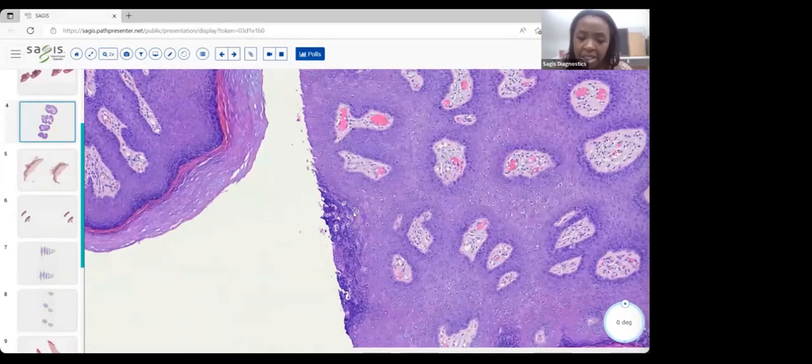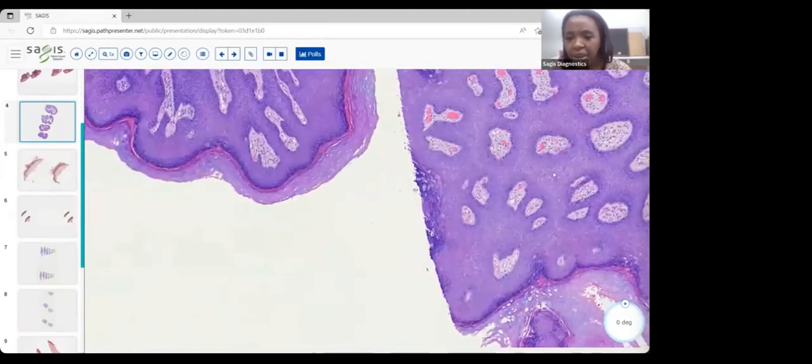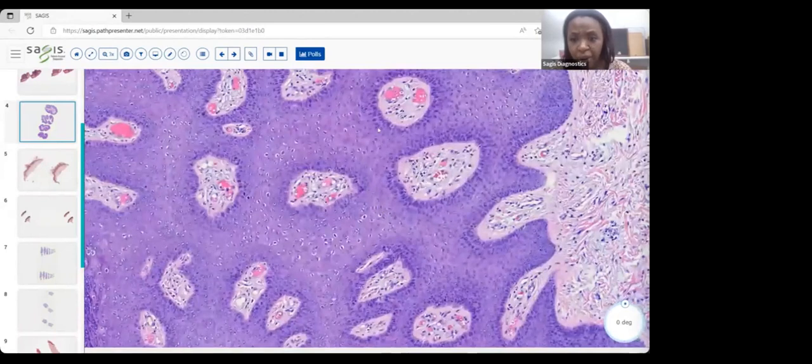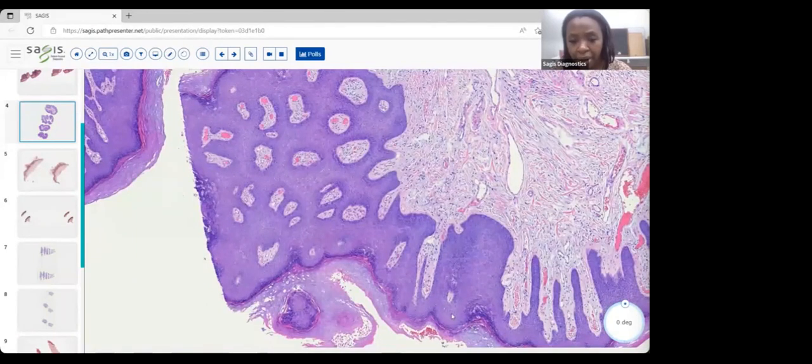We have our enlarged keratinocytes with these small, dark, dense basophilic nuclei, those pyknotic nuclei, and then the vacuolated cytoplasm around them, right? So there's a classic coilocyte. But look how far they go. These are many, they are numerous, and they go deep into the stratum spinosum. They really are going quite dense in there. So this is a quite prominent feature of our condyloma, and they really help us make the diagnosis.